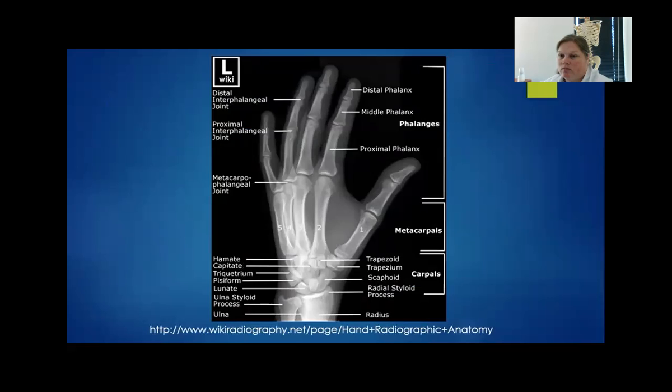The head of the metacarpal should not be overlapping the bony base of the proximal phalanx. The third should not be too much over the fourth. The fourth and fifth could be about 1/3 covered, but if the third and fourth are more than just slightly touching, that means they have over obliqued the hand. So this one is slightly too much. Come down to the IR just slight to help with that head not being overlapping on the bottom of the phalanx.